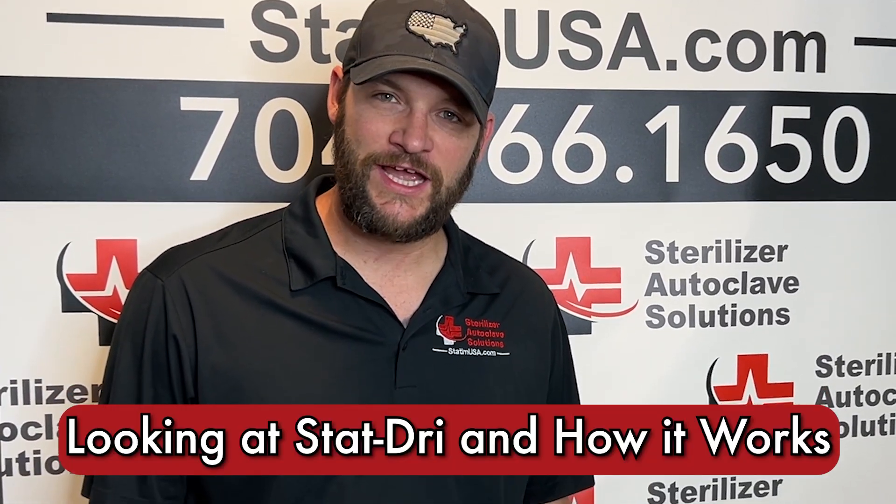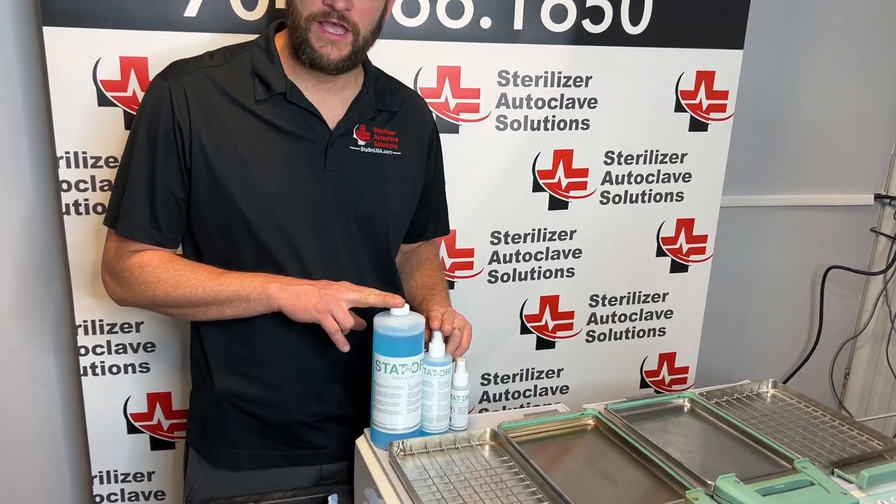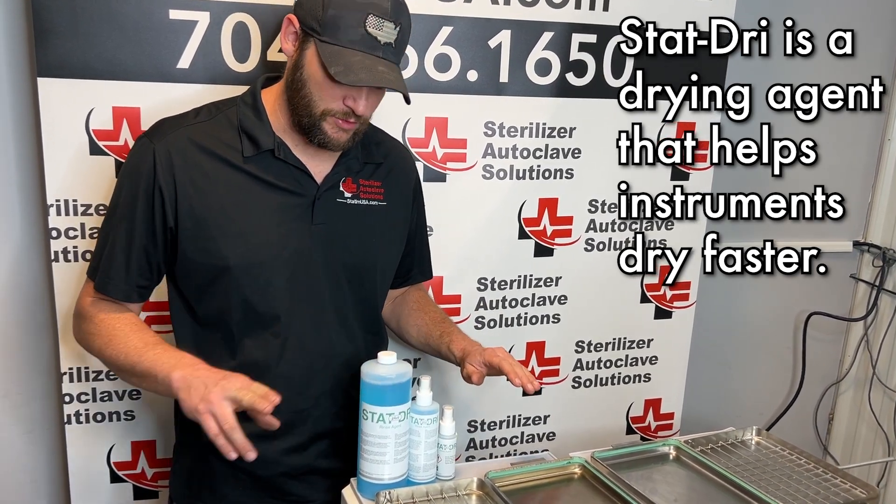Hi, this is Ian with Sterilized RelicLate Solutions. Today we're looking at the effects of STAT DRY on the STATUM 2000. STAT DRY comes in three different sizes and is used to help your packages dry faster, so you don't have to wait as long.